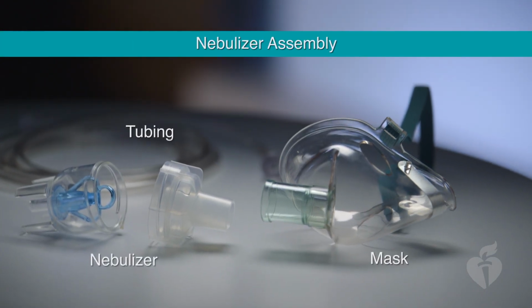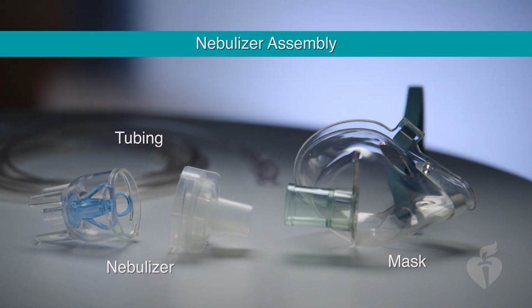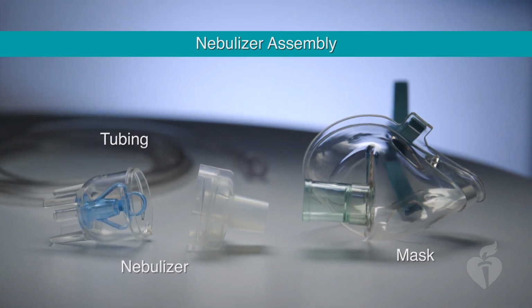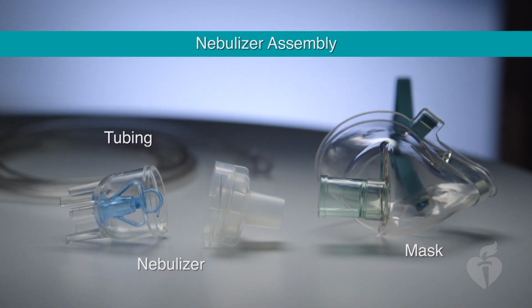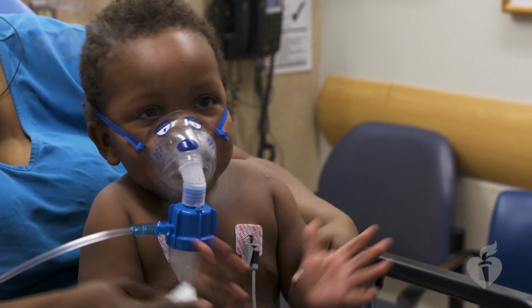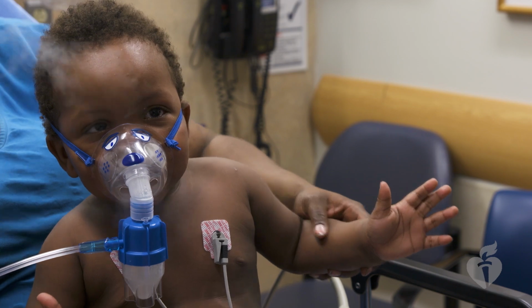A common respiratory intervention for children is administering inhaled medications by using a nebulizer. Components of a nebulizer assembly include a T-piece, plastic oxygen tubing, a nebulizer or atomizer bottle or reservoir, a mouthpiece or mask, and an oxygen source or compressed air. The nebulized medications are used to treat airway obstruction by opening the airway through either decreasing airway edema or improving bronchoconstriction. A cornerstone of treating respiratory emergencies in children is administering oxygen.